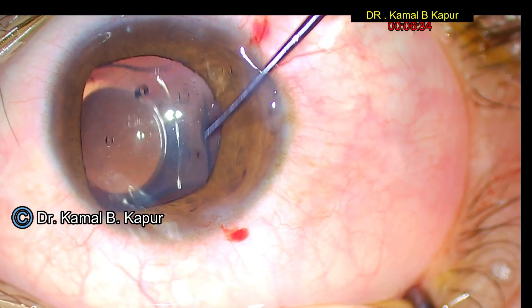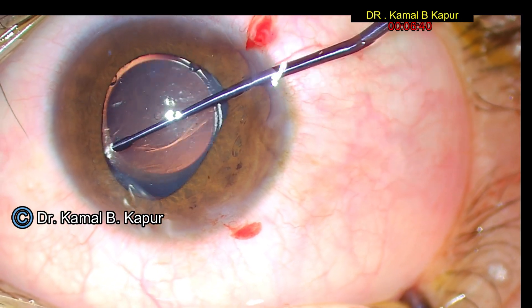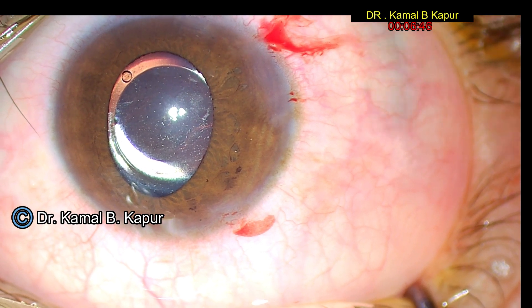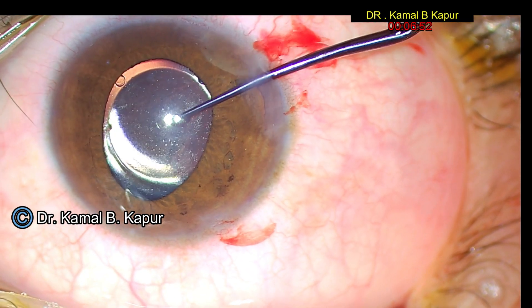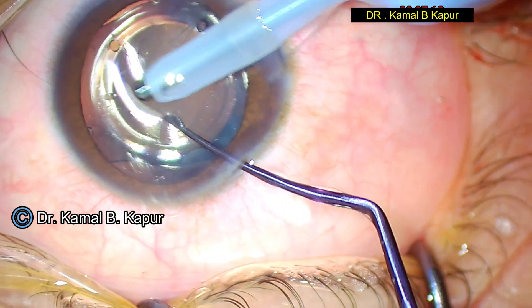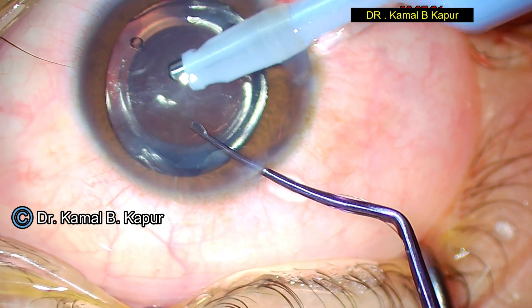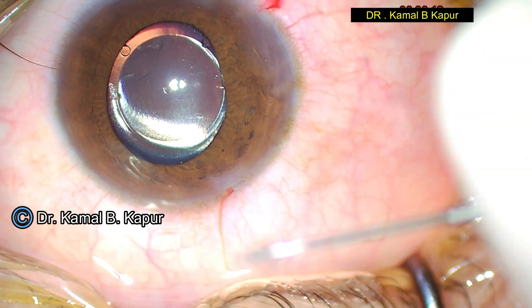The only difference here is that since this was a reversed phakic lens, I did enlarge the incision, which I normally would not need to do for a normally placed phakic lens. We then remove the viscoelastic from the eye, making sure all viscoelastic is removed, including from behind the phakic lens.